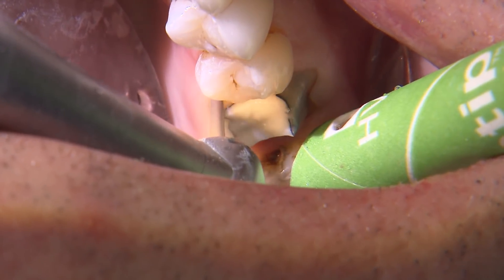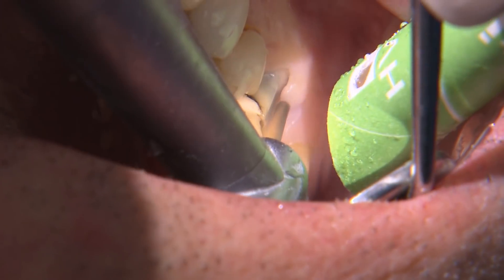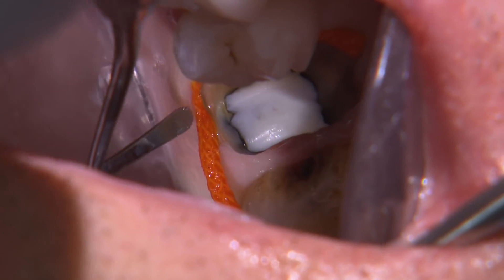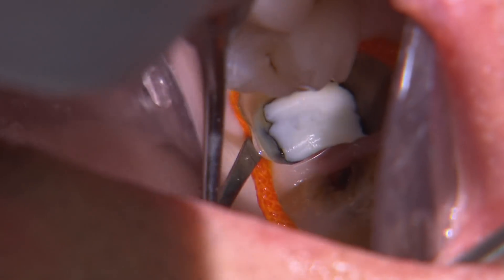I refine the rest of the prep following the same guidelines as before: chamfer margins, adequate taper, and rounded internal angles. I also place a size 2 cord here for gingival retraction since the margins are all equigingival.